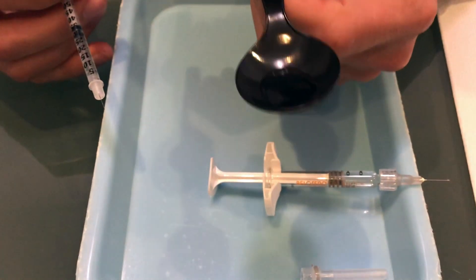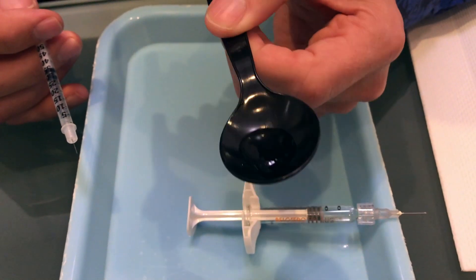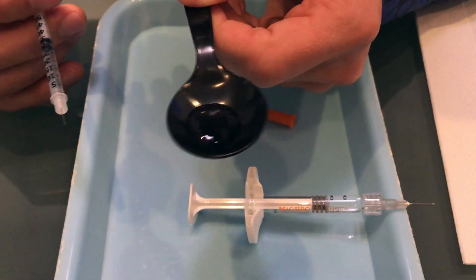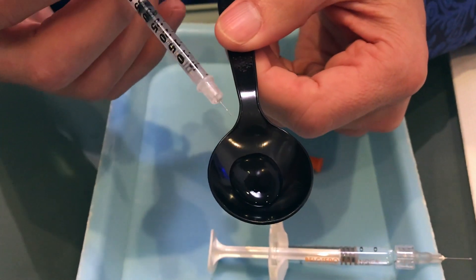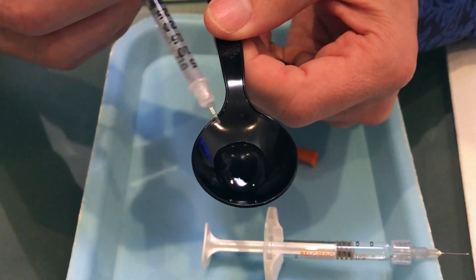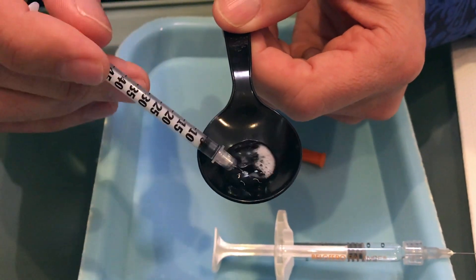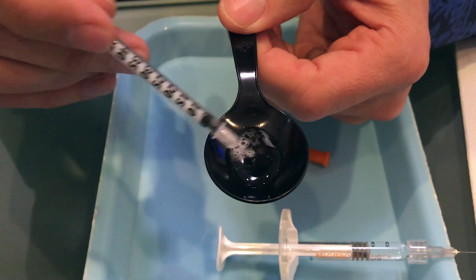So we're now about three minutes after the initial injection of Hylinex to dissolve the 0.5 of Bellatero and I'm going to add another 45 units, 0.3. I'm going to see if that liquefies it.